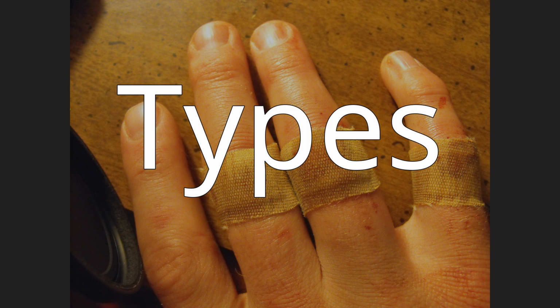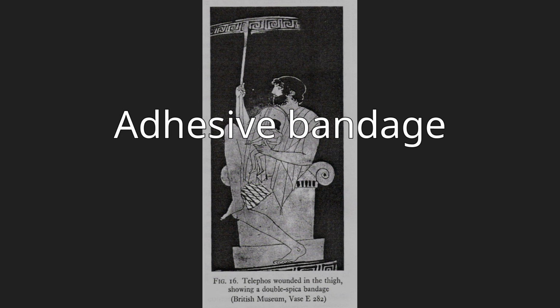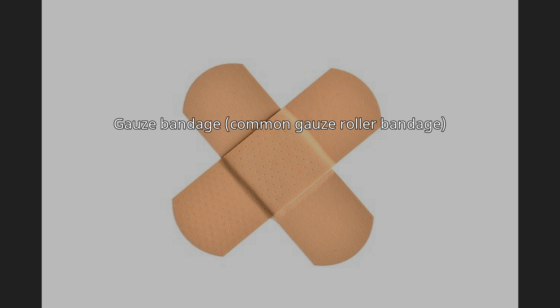Types: adhesive bandage, liquid bandage, gauze bandage, common gauze roller bandage. The most common type of bandage is the gauze bandage, a woven strip of material with a telfa-absorbent barrier to prevent adhering to wounds. A gauze bandage can come in any number of widths and lengths and can be used for almost any bandage application, including holding a dressing in place.